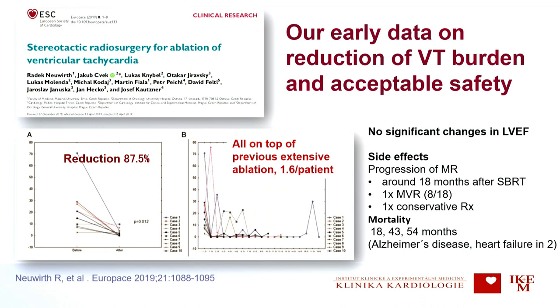And these are data published from our group, actually all data from Třinec, from the Moravian center, but together with us because we joined this consortium. And they had in these first 10 patients a significant reduction of therapies. But you can see here over time, there are some late recurrences or sometimes the effect is delayed. So it's not a treatment that would cure the patient, obviously. And there were some side effects like one progression of mitral valve disease.